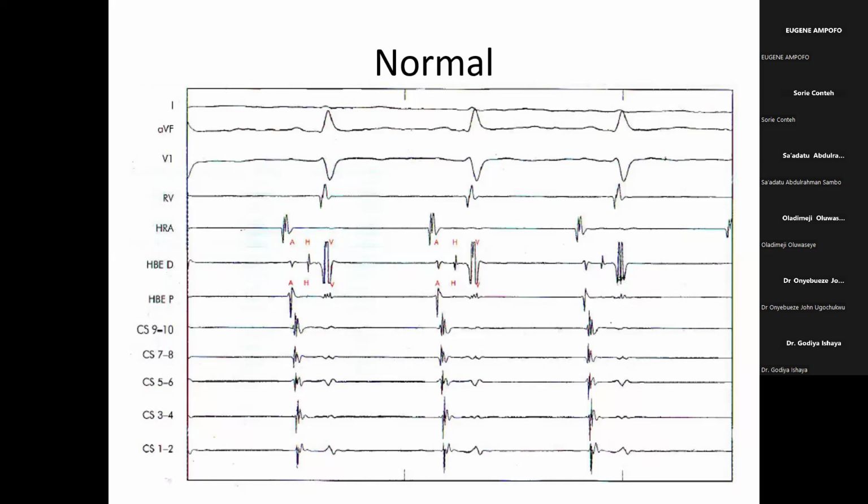Okay, so as I said, the HIS signals can be distal in the catheter or proximal of the catheter. And you can close any of the channels if you don't want them. Okay. Now, CS catheter, remember they labeled it, right? From CS1 to 10. We saw how they labeled it. That means that the most distal end is the CS1 and 2, right? Which is closer to the left atrium, right? While the proximal end is closer to the right atrium. True or false? Sure. Yeah, great.